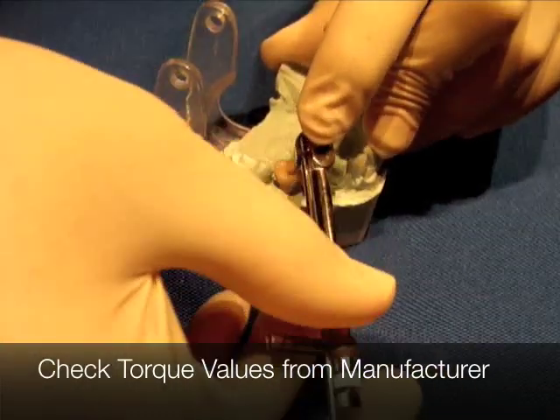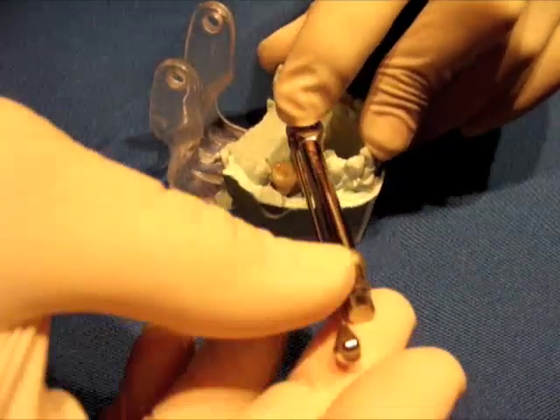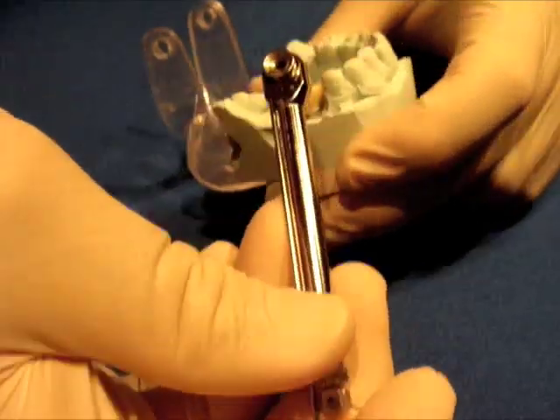Usually if there are two crowns, I'm doing a little bit on one, a little bit on the other, going back and forth. I'm kind of showing you what one would be like, but really it should be seated down properly on top and then tightened in.